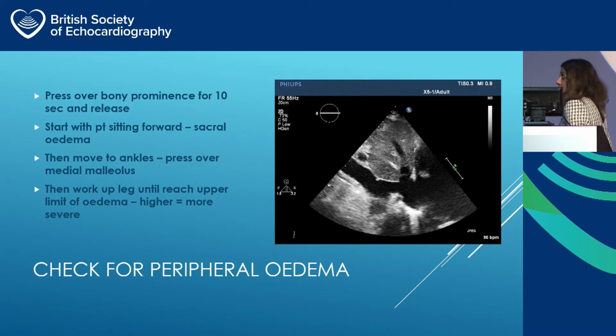This is a dilated IVC. It's probably not going to play. It's not collapsing. And you will see this on your echo in someone with severe peripheral edema. If you've got a beautiful IVC that's collapsing away, then you've got to ask yourself, was that peripheral edema?